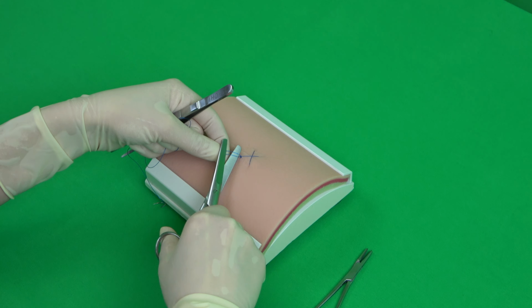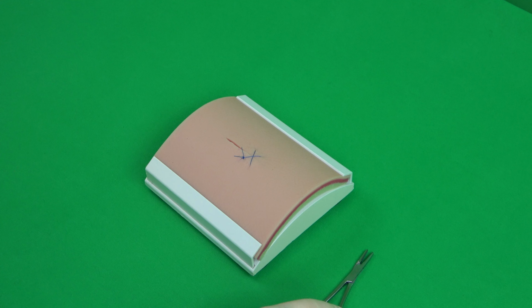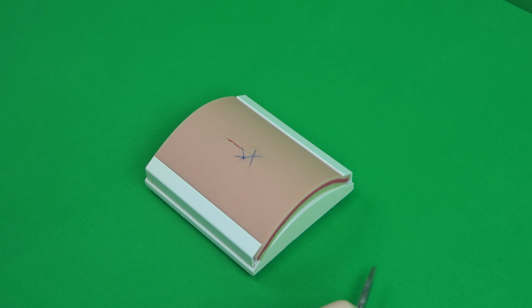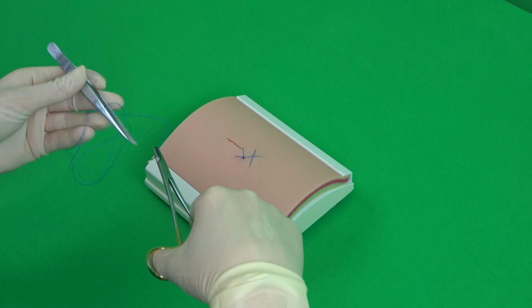Finally, the suture ends can be shortened to 1 scissors blade width. After the wound is adequately healed, the skin sutures can be removed with a pair of ligature scissors. For repetition, the placement of a further interrupted cruciate suture will be demonstrated.